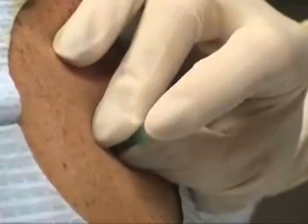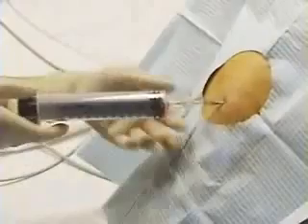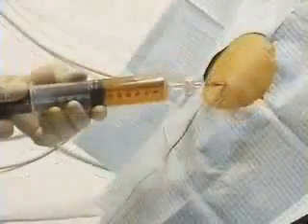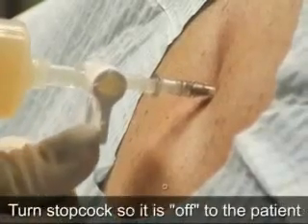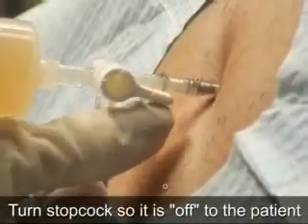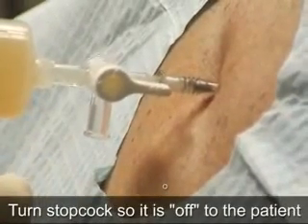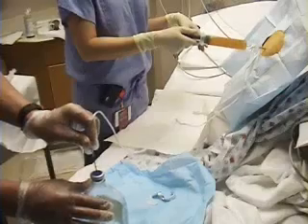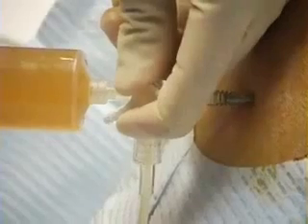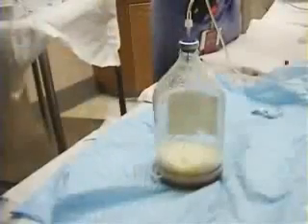Next, attach the three-way stopcock and large syringe to the catheter and continue to aspirate fluid. When this syringe is full, adjust the stopcock so that it is closed to the patient. The stopcock should be open to the patient only when fluid is being actively drained. If additional fluid needs to be drained for therapeutic purposes, attach the collection tubing to the stopcock and to the evacuated container. Open the stopcock to the patient and to the tubing and allow the evacuated container to fill.